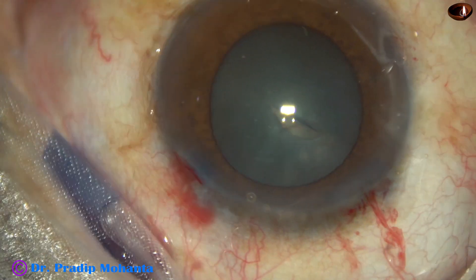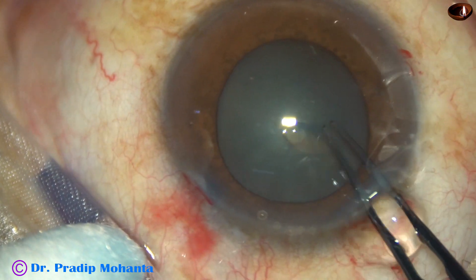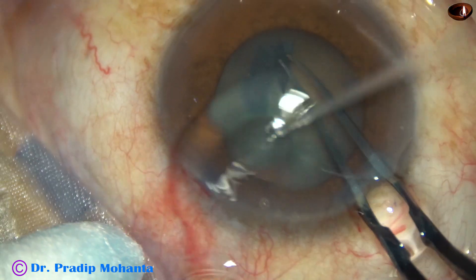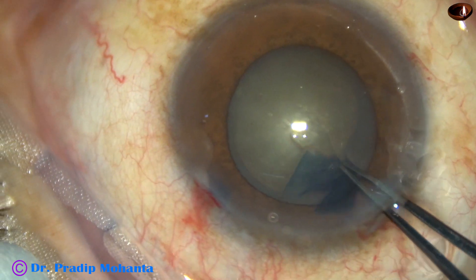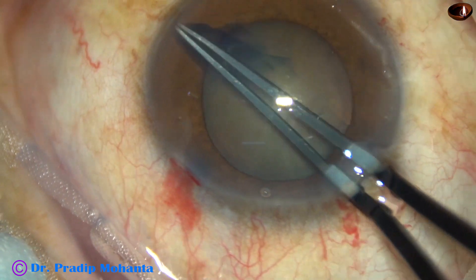A capsular tag is raised by a 26-gauge bent needle. I use Utrata forceps, hold this capsular tag, and go anticlockwise. In this case, I am going very close to the pupillary margin to get an adequate sized rhexis.